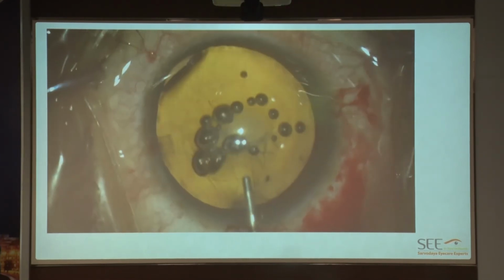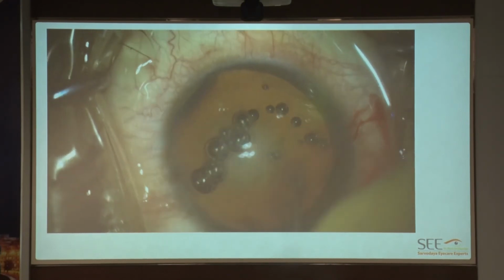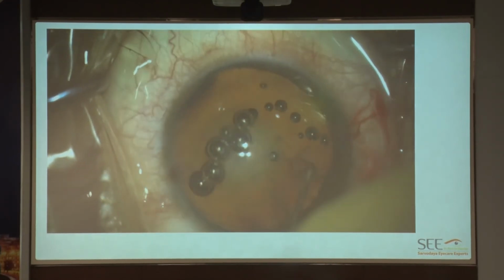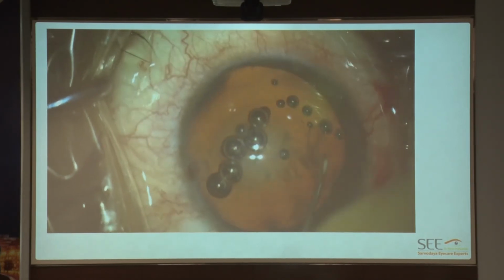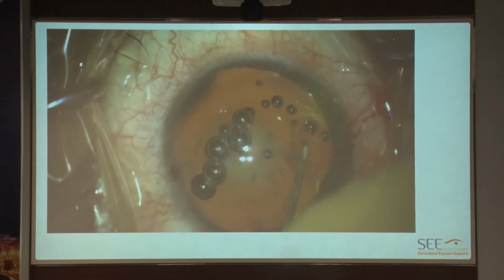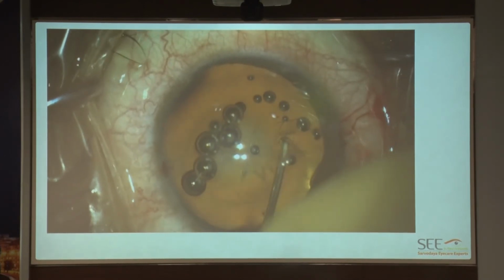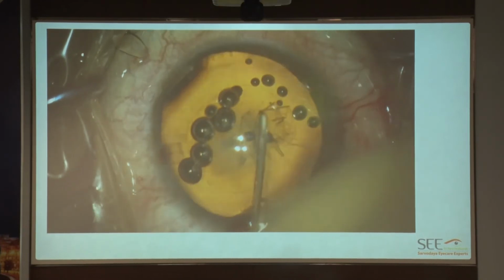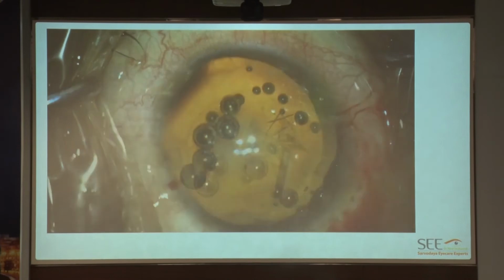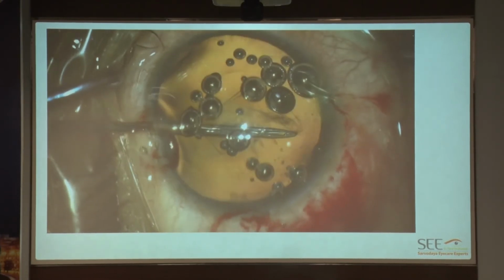It is important to start your capsular rhexis away from the area of zonular dialysis. In this patient, when I came near the second area of zonular dialysis, I went into the anterior zonular fibers. One should avoid that, because once it goes there, it sometimes becomes very difficult to bring that rhexis back. But if you have a very strong centripetal force with the help of capsulorhexis forceps, you'll be able to get that rhexis back to the center.